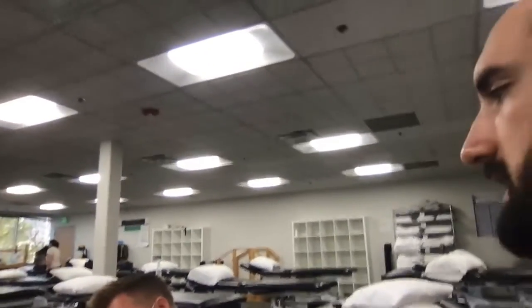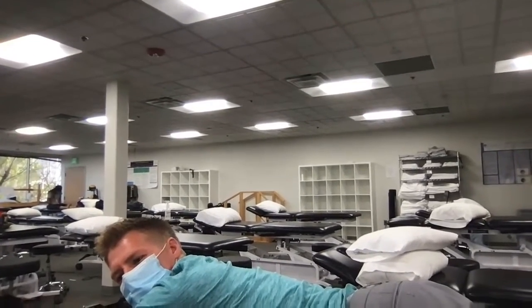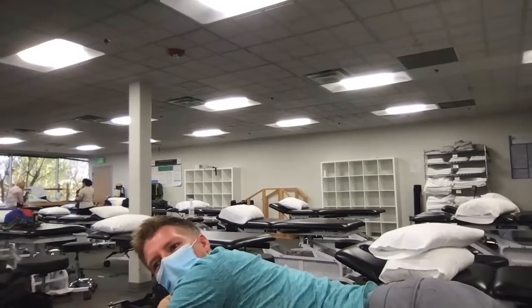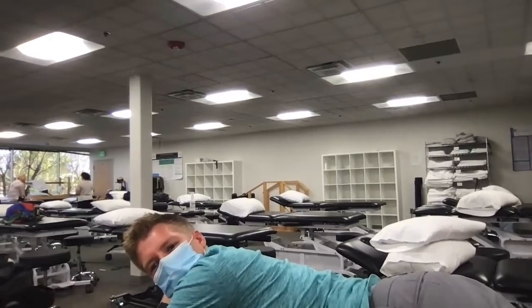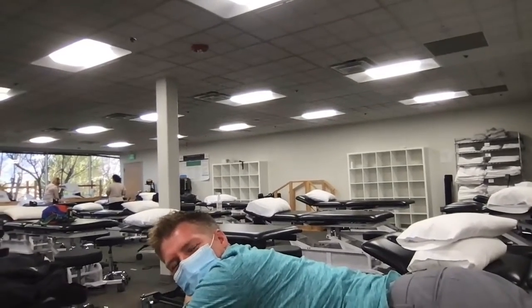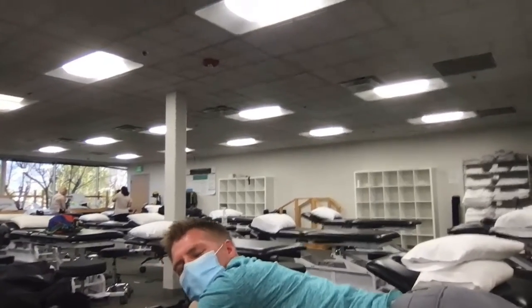Okay, and actually just before we get started, I want to ask you a few questions here. Do you have any altered sensation or circulation in that area? No. Okay. And do you have any history of cancer or blood clots? Nope. Okay. Do you have any cemented joints in that area? Did you ever have low back surgery for fusion? No. Okay. And are you currently pregnant? No. Okay, good. So let me just know if you experience any sort of discomfort over the course of treatment, okay? Don't try to bear it, just let me know. More isn't necessarily better with this type of thing. Okay. All right?